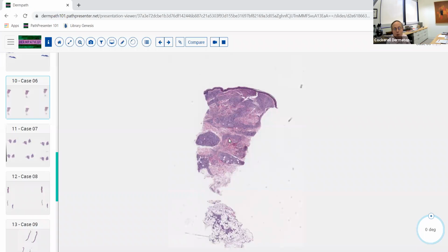And then finally, when you get to polar lepromatous, you get very, very few sarcoidal granulomatous inflammatory infiltrates, and you get this more diffuse foamy histiocytic reaction that can be very diffuse. In fact, it can involve virtually the entire dermis, going from the grenz zone beneath the epidermis all the way down to the subcutaneous fat.